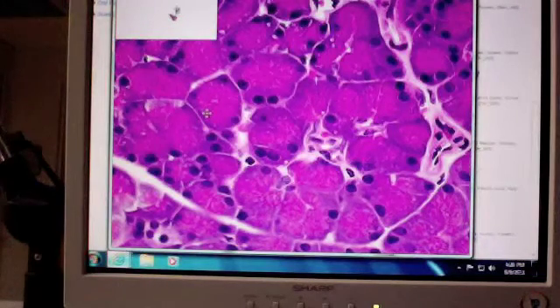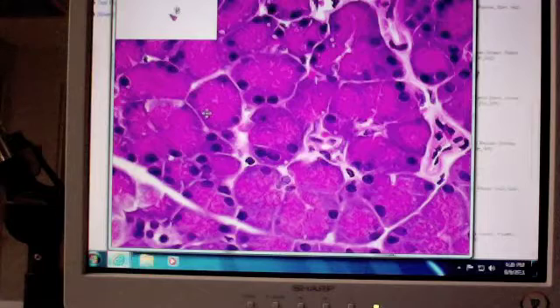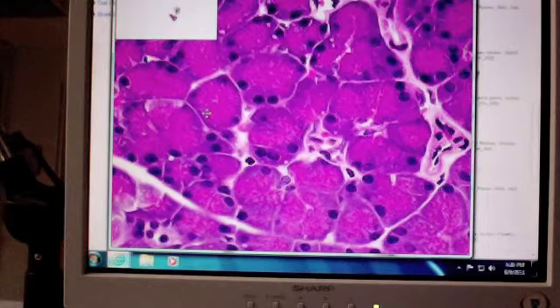I have a question all the way at the back there. I saw a hand. This I would like to have seen called a compound multicellular gland, okay? But if you called it a serous gland, that would be fine. But what it is definitely not is any kind of simple gland, and it's definitely not a mixed gland.